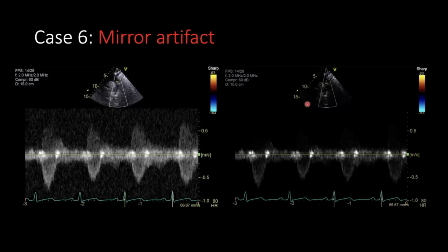Sorry, so if anyone couldn't hear, Veen was just mentioning that in GE machines, you tend to see bleeding color artifacts quite commonly, where the color doesn't respect the flow and can go outside of the flow. But it's more commonly seen in GE. And if anyone has more, they can please feel free to chime in.